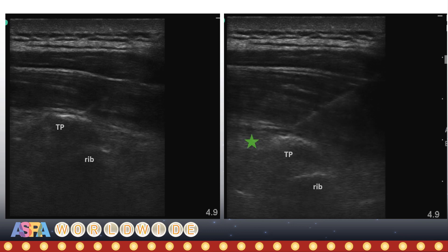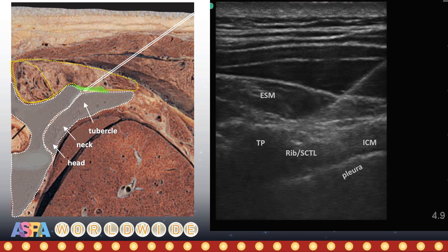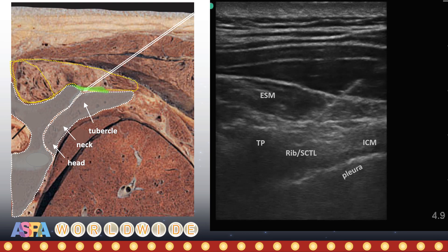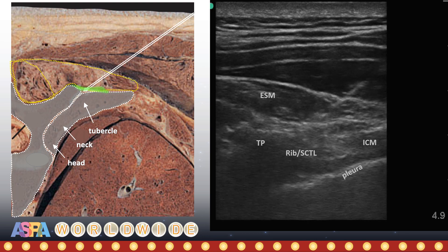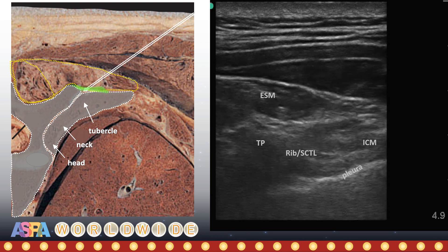If necessary, the needle can also be advanced deeper into this space. A transverse in-plane approach is also an alternative way to perform a single-shot ESP block, the advantage being that it is easier to see the costal transverse junction and to appreciate the muscle layers and fascia. You can see a good separation and lifting of the erector spinae muscle off the tubercle of the rib, as well as off the intercostal muscles and superior costal transverse ligament. As an aside, some of you will note that the lateral paravertebral space is also clearly visible here.